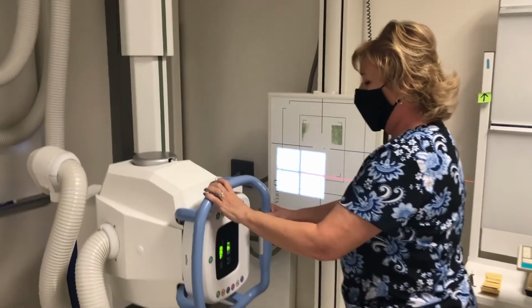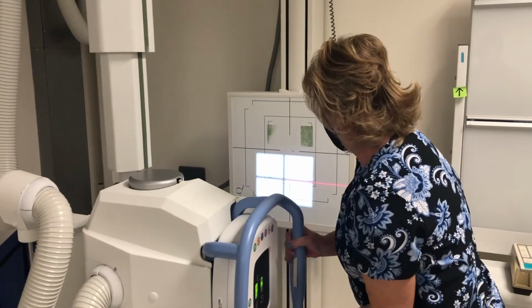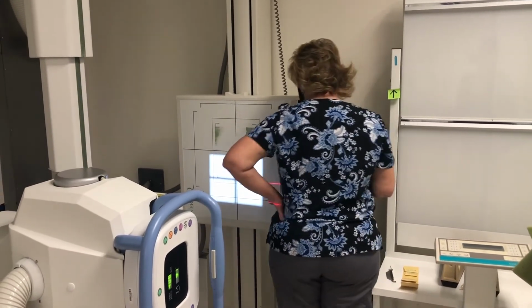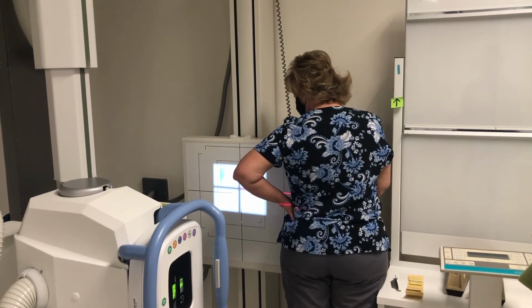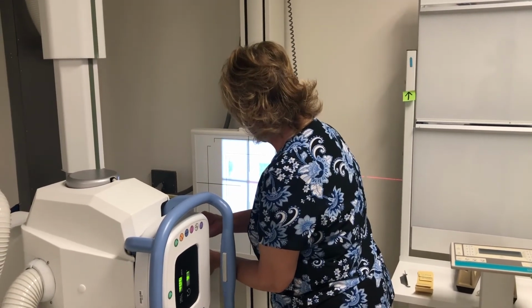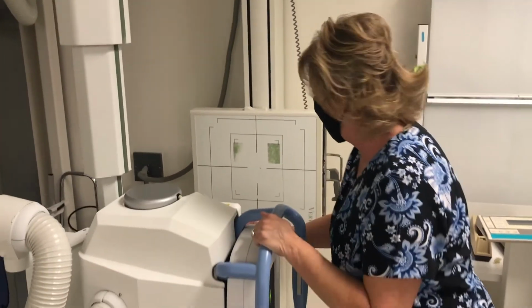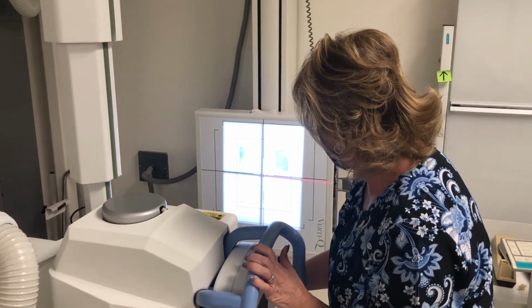And again, like we've talked about, when I'm bringing my patient into the room, I'm kind of comparing my height to their height. So while she's in the bathroom and I'm setting up for this, I'm kind of adjusting this to where I think her crest might be, so that I don't have to do any major adjustments once she's back in the room. By 17.